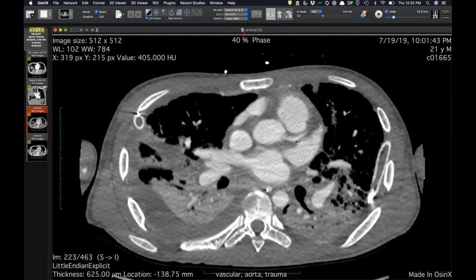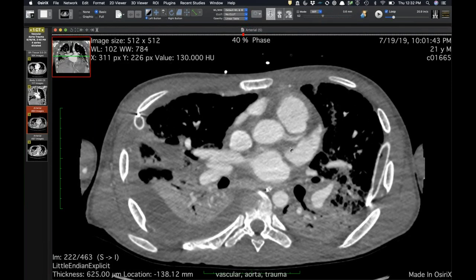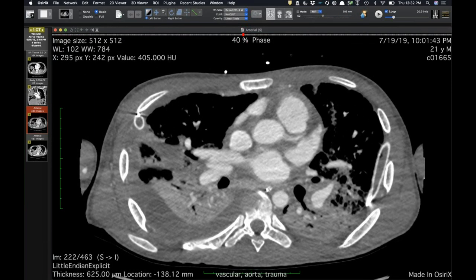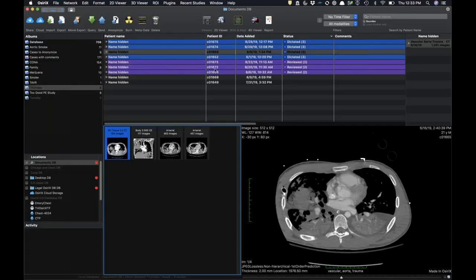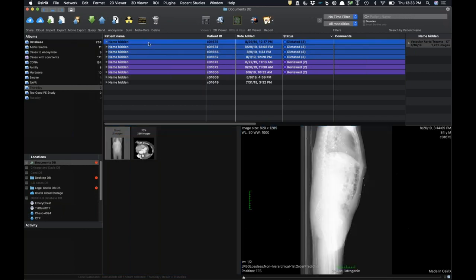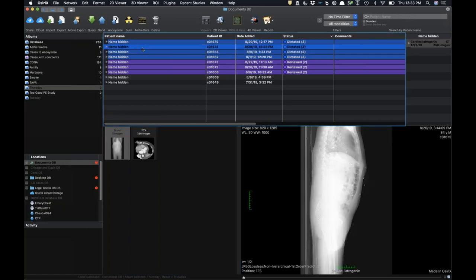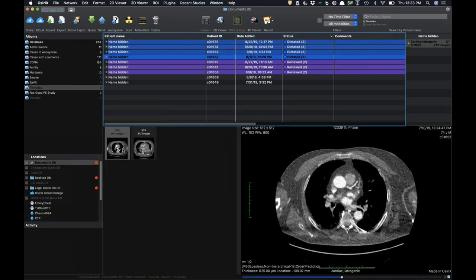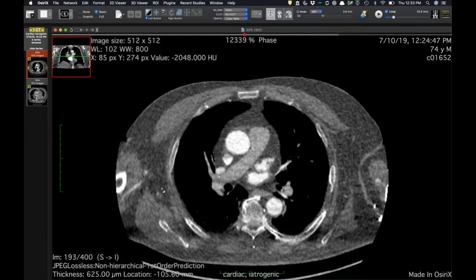Traumatic aortic injury at the aortic root with also a traumatic dissection involving the left coronary artery. Has anyone seen coronary artery dissection in blunt trauma? We had one here that was an LAD dissection — the imaging wasn't great, but there was ischemic injury in the LAD territory, and on CT there was just poor filling of the LAD.